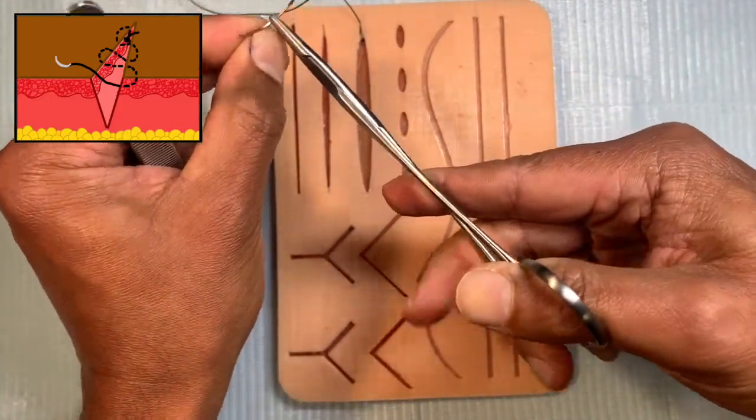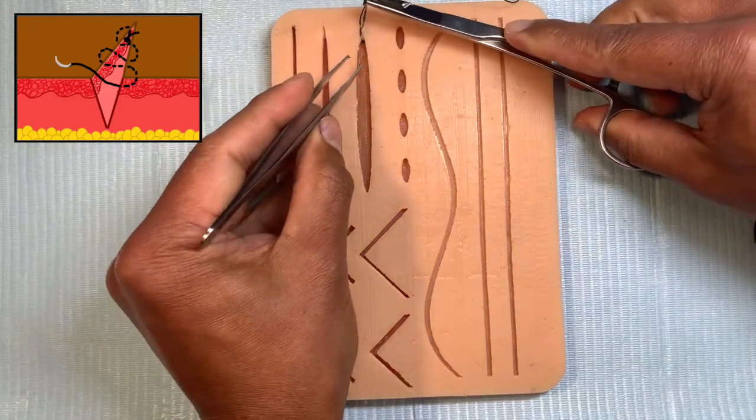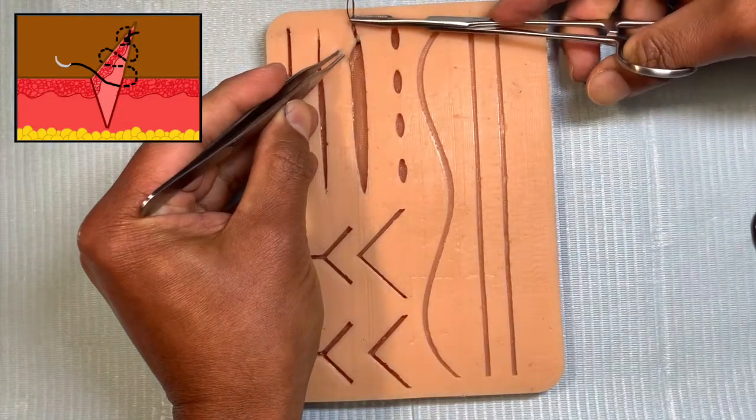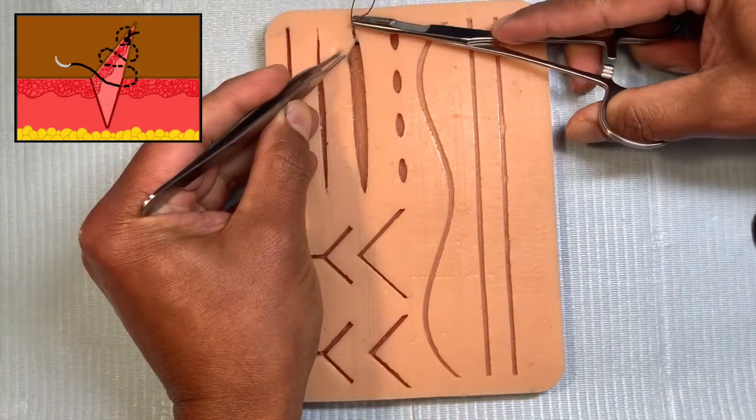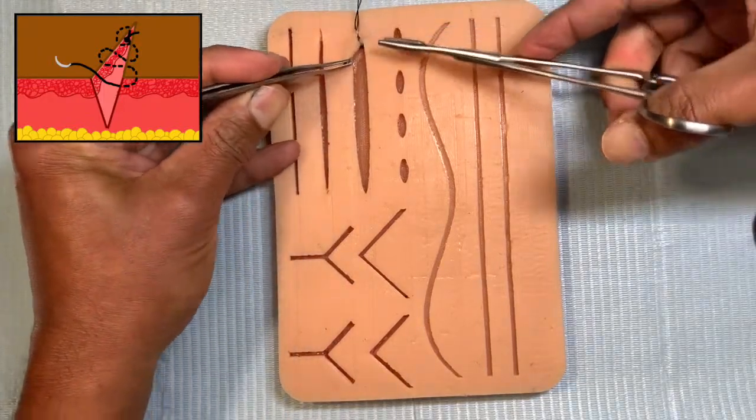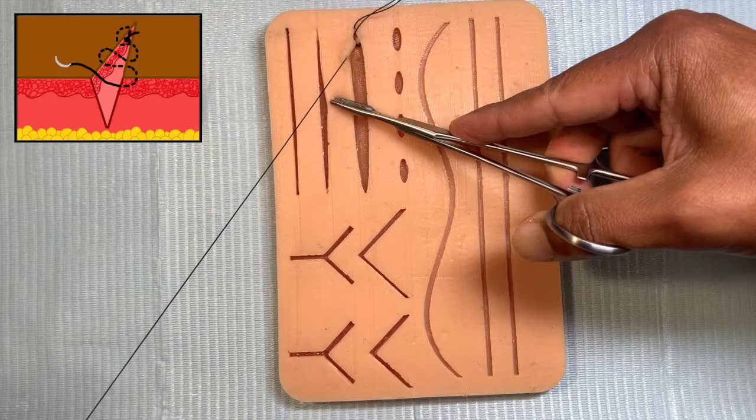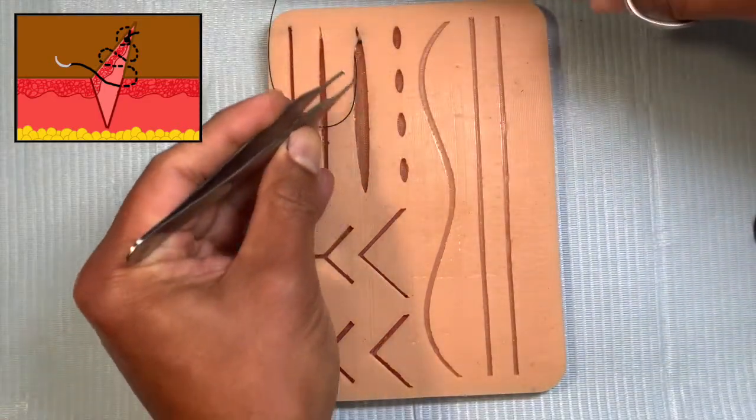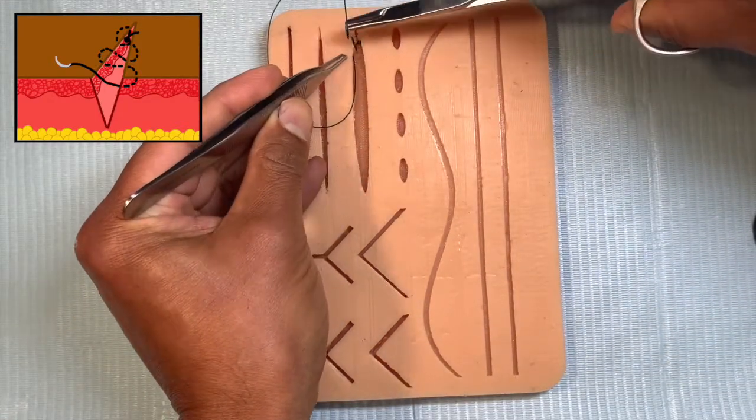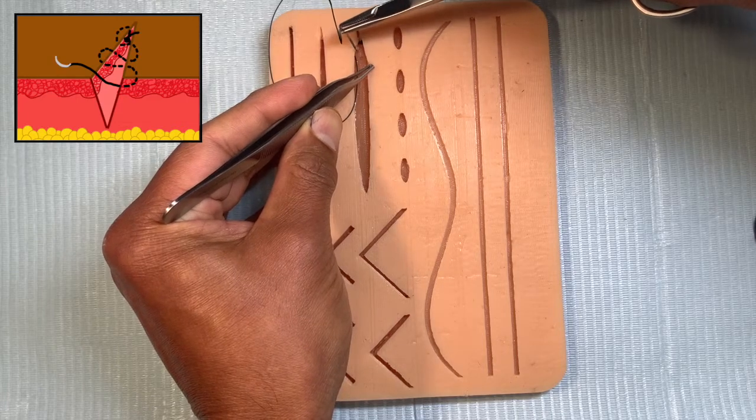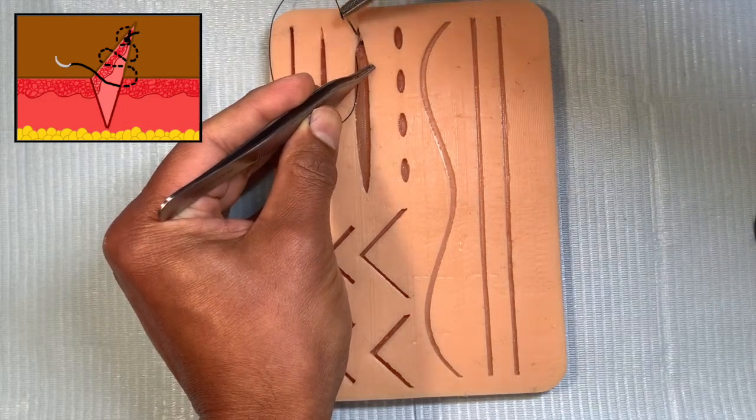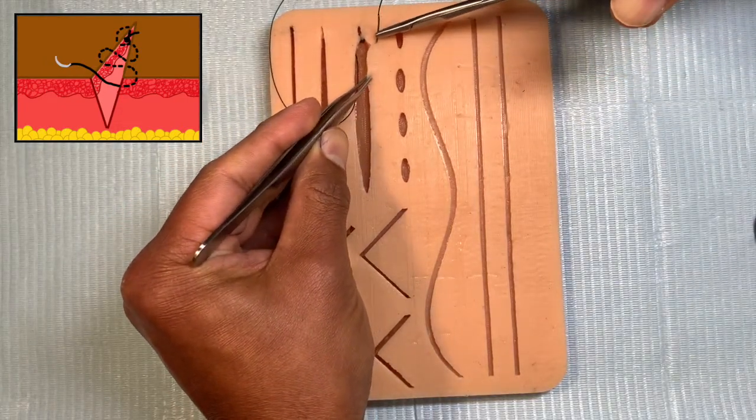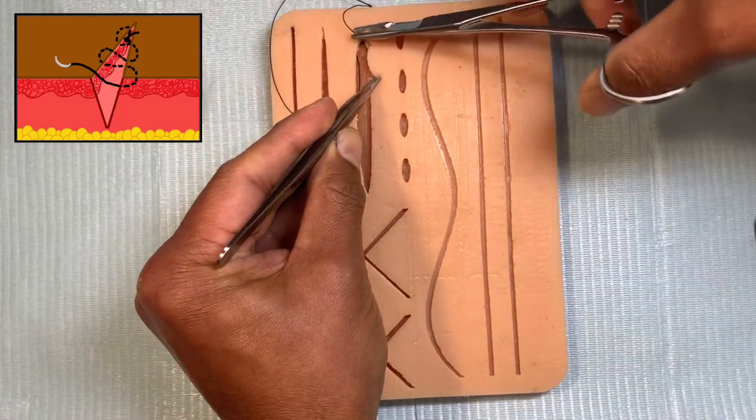Now I've got a good startup and I'm going to run this towards me because ergonomically this is much easier. Take a bite through the papillary dermis and bring it out. You can hold the needle with your forceps. I've come on that side and I'm going to pass it maybe not opposite but just slightly behind, then pass the needle again in the intracuticular plane through the papillary dermis.